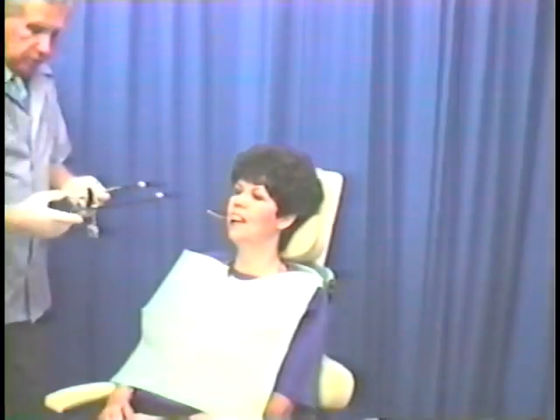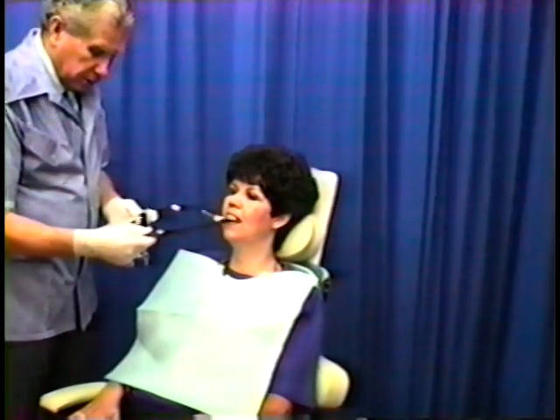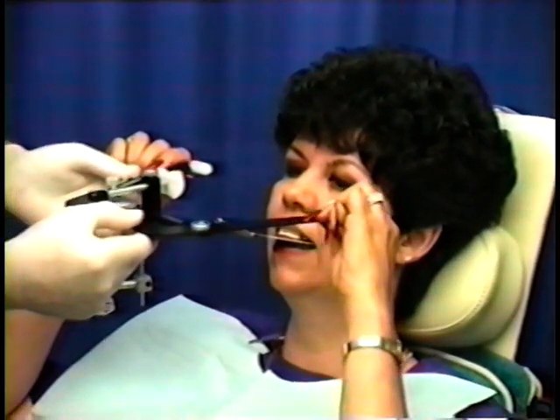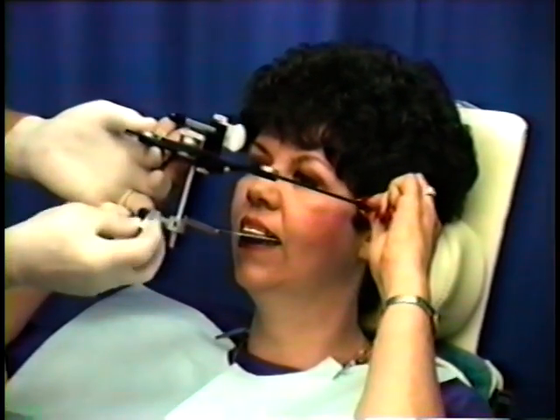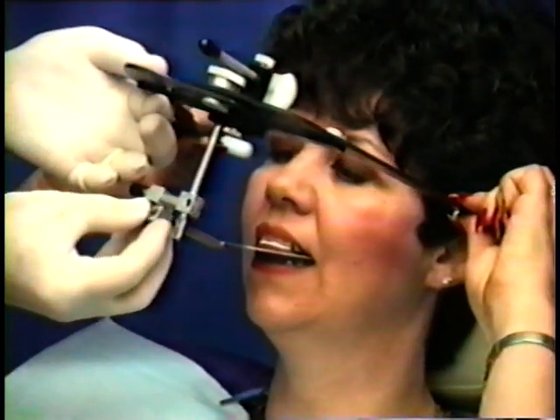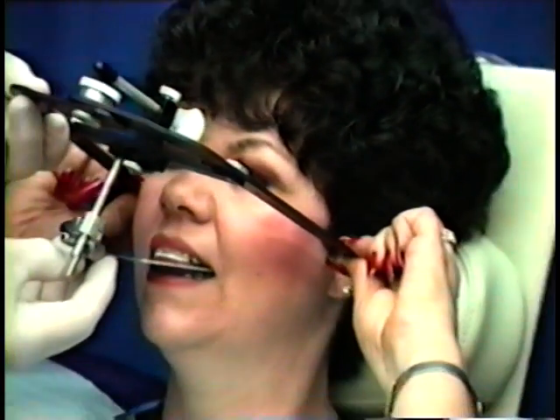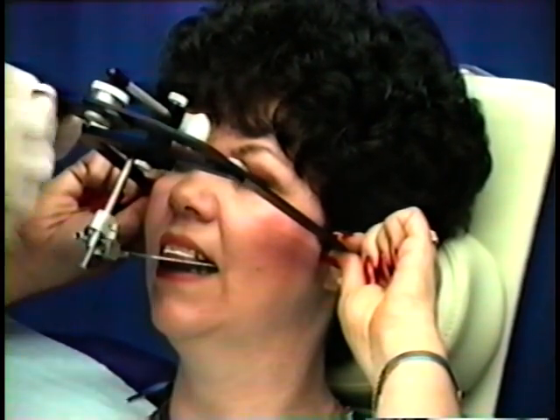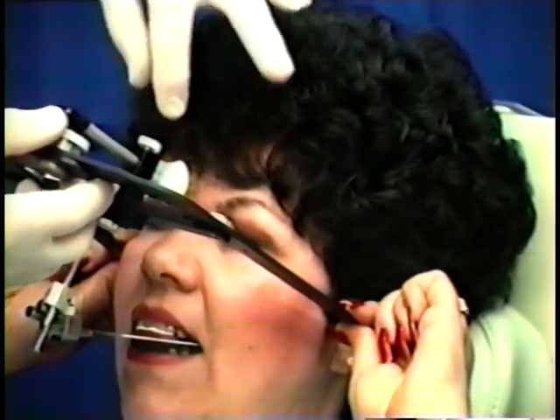We're now ready to attach the face bow to the bite fork. Instruct the patient to reach up and grab the side arms and hold them beside the face, while slowly attaching the toggle to the protruding stem. Once over the stem, the patient can now put the ear plugs deeply into the ear, into the external auditory canal.